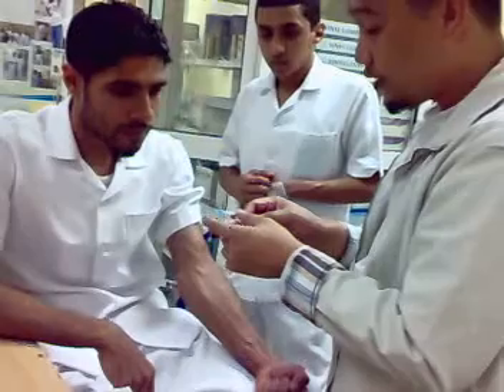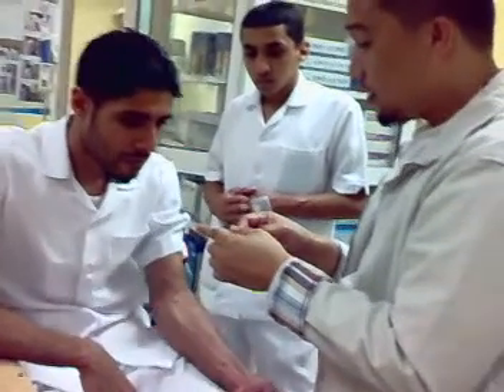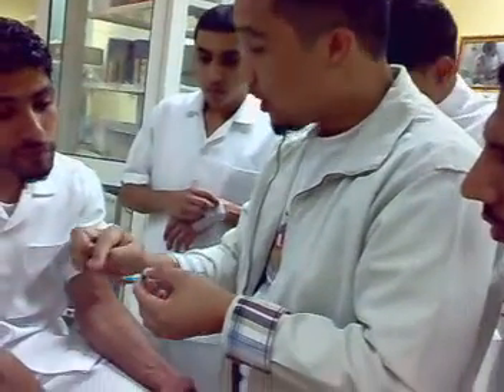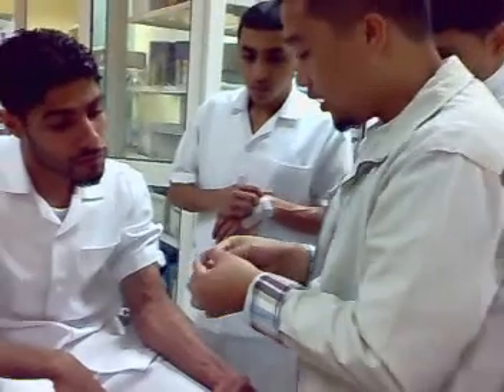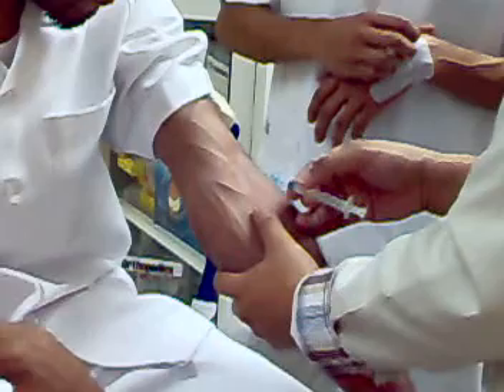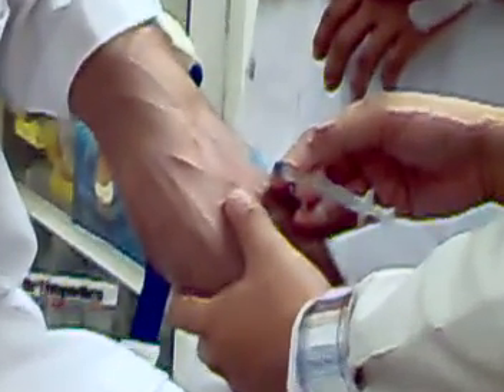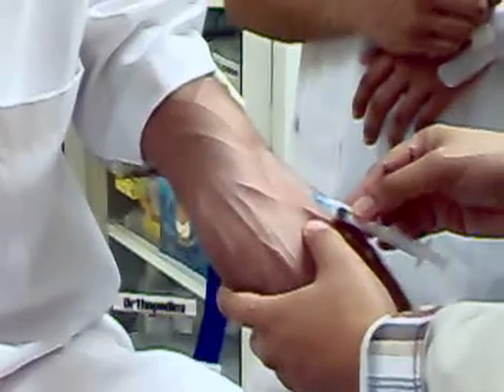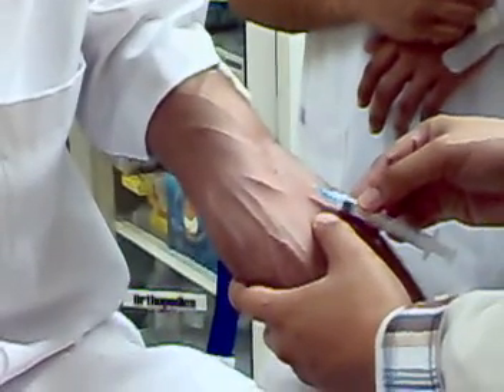When injecting the needle, you have the so-called bevel, and this bevel should always be injected facing up — it should be in the upper part. For all IV insertions, the proper angle is 30 degrees, but it depends on the skin and the vein. For example, in this case I can go at 20 degrees — no problem.